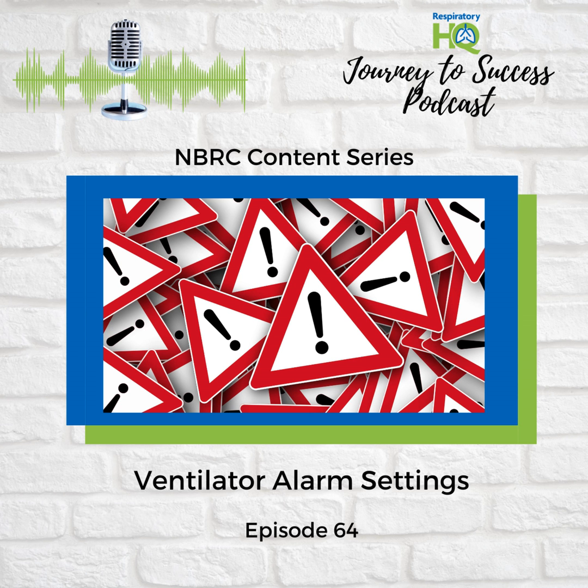Okay, that makes sense. And the last one on the list, the apnea alarm. Apnea means stopping breathing, right? Yes. So the apnea alarm has a time delay built in, usually around 15 or 20 seconds. If the ventilator doesn't detect any breath from the patient, either spontaneous or triggered, within that set time period, the apnea alarm sounds. It's a vital backup. So if the patient just stops breathing effort for, say, 20 seconds, the alarm goes off, and typically the ventilator will then automatically switch to a backup mode and start delivering mandatory breaths to ensure the patient keeps getting ventilated.